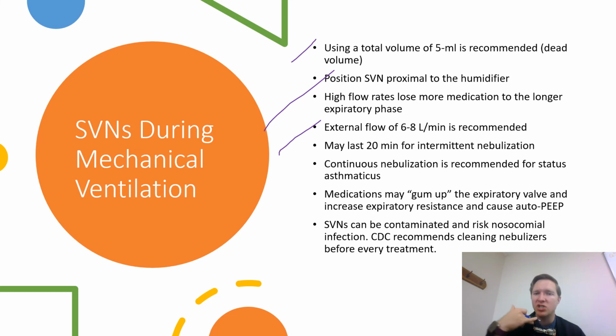It's just saying, hey, in general, a slower flow rate, just like your slow inhale technique with a nebulizer, you want that to be as close as possible in theory. So are you going to be changing this every time you do a nebulizer? Maybe not, right? But it's just saying that would be the most optimal way to do it.